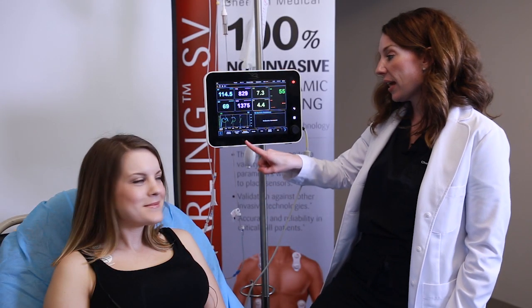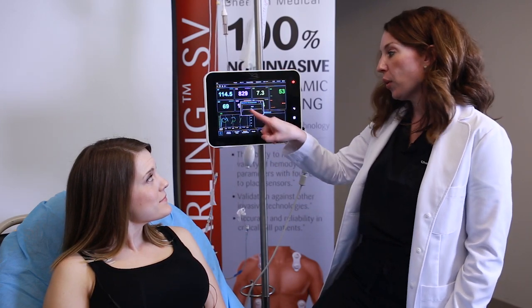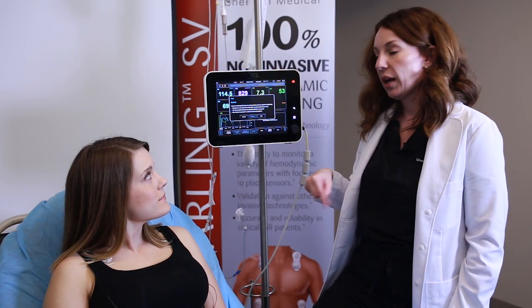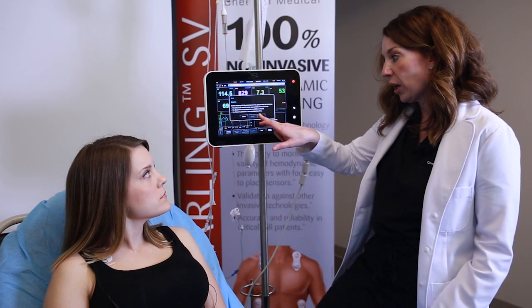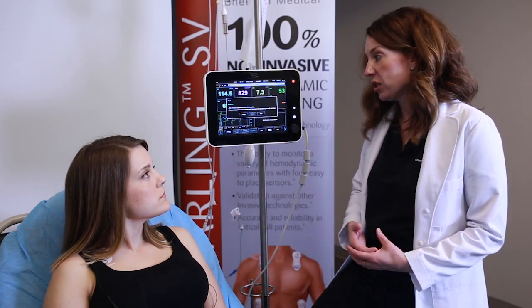Okay, so we're going to select dynamic assessments, and then we're going to select PLR. And I'm going to go ahead and read to you what the wizard is telling you to do. So PLR baseline. Before initiating a PLR dynamic assessment, please verify the following. The pillows are removed from under the legs and the foot of the bed is flat. The sequential compression devices, your SCDs, are removed. And the patient is placed in a semi-recumbent position, which is how we have our Annie here. We're going to go ahead and hit next since we're properly positioned.